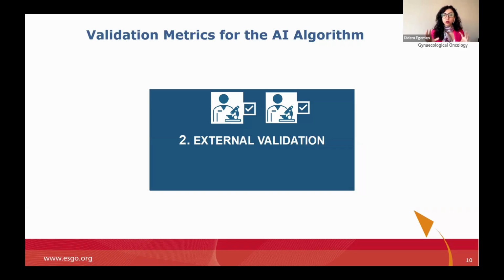If you want to make sure that an AI algorithm will perform well, it should be tested on other external data sets. In our example, we used 5 different studies to train our algorithm, and our PAVE consortium is our external validation study. The results I showed you are from our external study. We still incorporated a small amount of data since we changed the device.